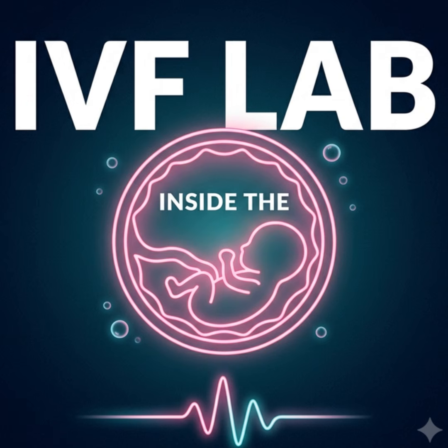But wait, I want to push back on this a little bit. We are talking about keeping the embryo in the dark, undisturbed. But a time-lapse system involves a camera taking a high-resolution photograph every 5 to 10 minutes for 5 days straight. That requires light. Doesn't flashing a microscope light on a highly sensitive embryo thousands of times cause phototoxicity? Isn't that worse than the temperature drop?